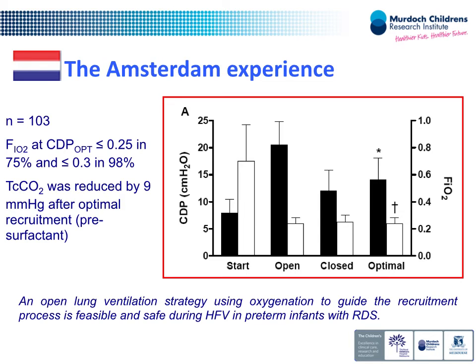I don't have the exact number in my head, but if you look at 24 weeks, most of these babies, unless there's no antenatal steroids, it's different depending on the individual and the circumstances prenatally also. But most of these babies actually do fine on nasal CPAP. They get into trouble after the RDS period, with apnea or sepsis, and then get into this ventilation time, and then you get into this chronic lung disease issue.